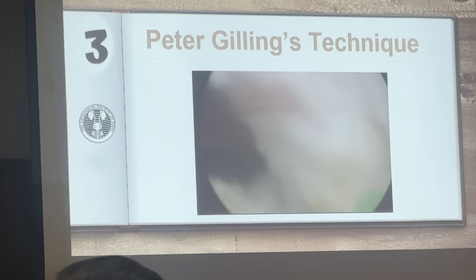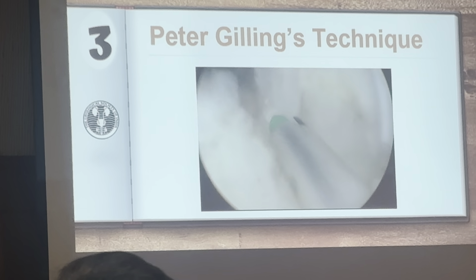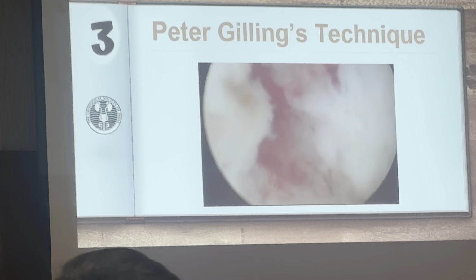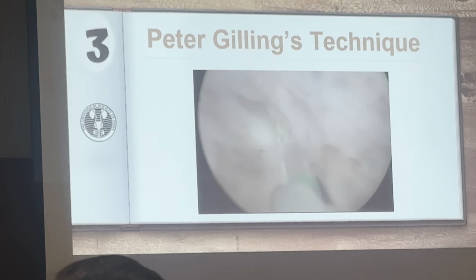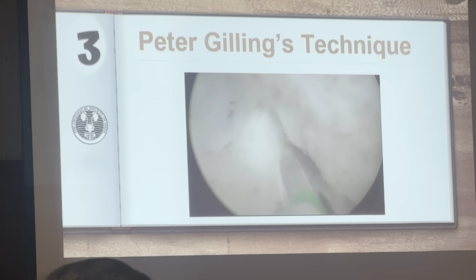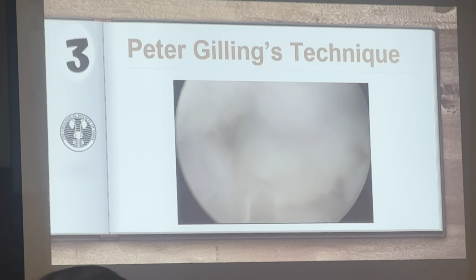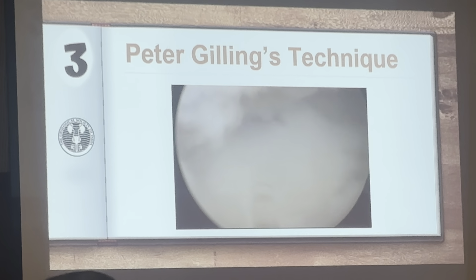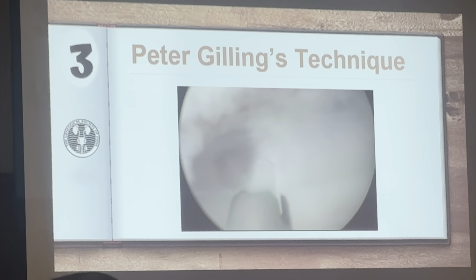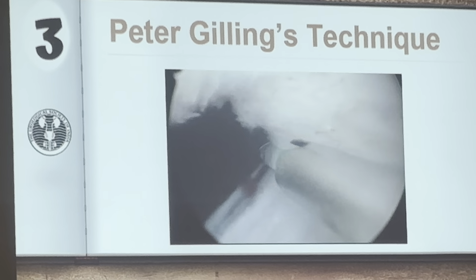Then what I do is again mushrooming from 12 o'clock. I am coming down, so I've almost come down to 1, 2, 3 and 4 o'clock. So the entire lobe has been displaced from above downwards. Once that is done, I start from below with my incision at 5 o'clock, and then I gradually sweep the lobe up. So from 5 o'clock I am going to 4 o'clock, 3 o'clock. So from above I am displacing it below, and from below I am displacing it up. And once we meet, the final few fibers are there, and we can completely enucleate the lateral lobe.